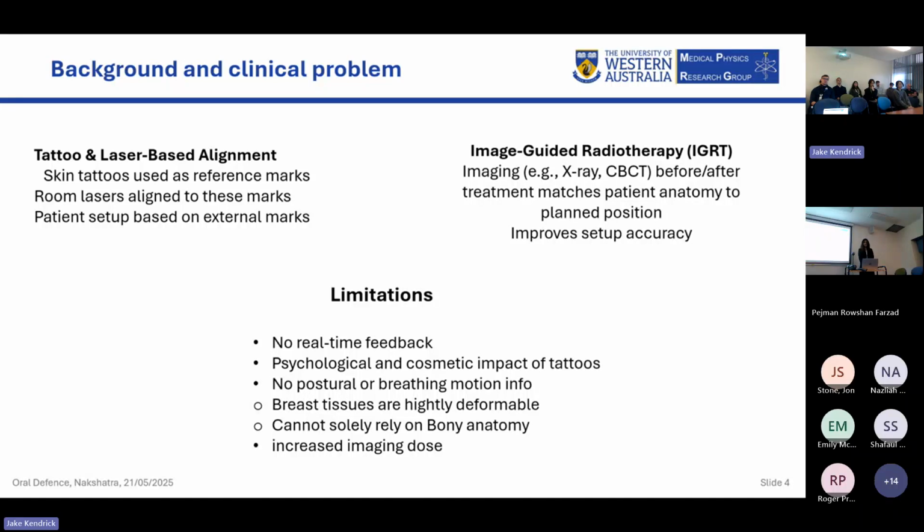Another reason is breast tissue can move and deform quite a lot, and relying only on bony anatomy is not reliable enough. So these limitations open the door to a new advanced patient positioning technology like surface-guided radiotherapy, which we'll look into next.